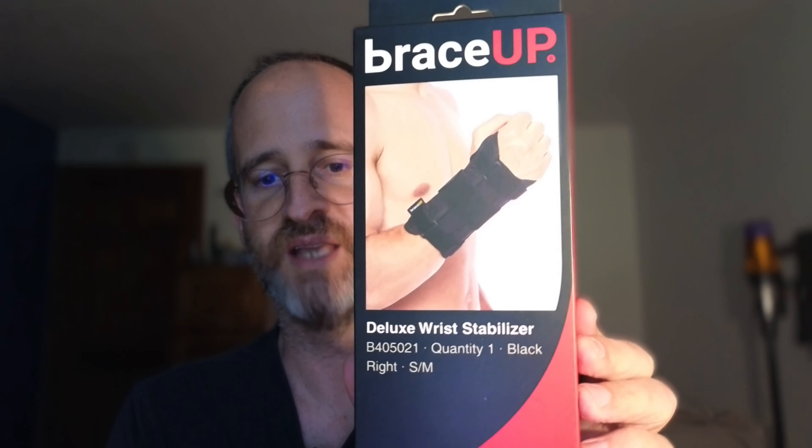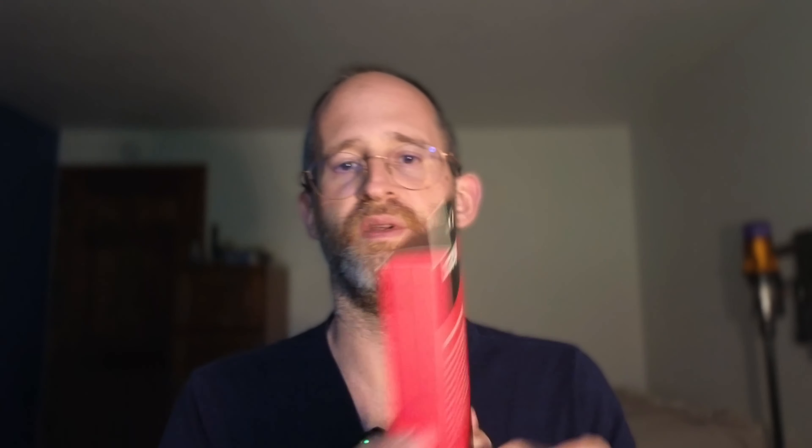It's Mike here and today we're gonna be taking a look at this Brace Up wrist stabilizer that the company sent me to review. So let's take a look at exactly what we're gonna get if you decide to purchase this.